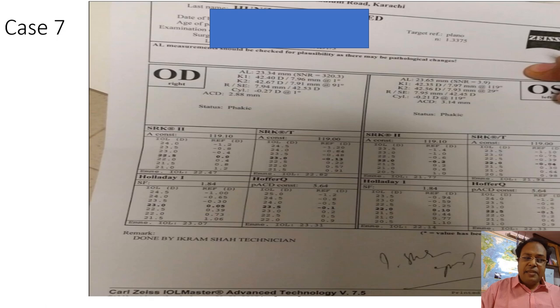The other thing that this case very well points out is, you get data from your optical biometry, but how reliable is that data? Before you look into the axial length, before you look into the K reading, how reliable is that data? One of the things that the IOL Master 500 had, the older version, it's now the IOL Master 700, but the version before this, the IOL Master 500, had a signal to noise ratio. And this is very important to me.